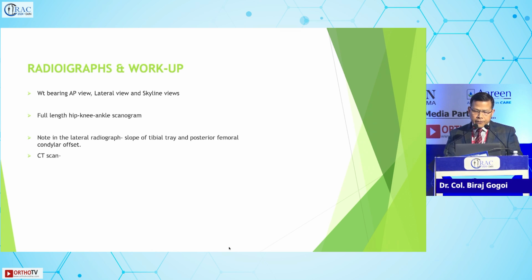And on radiograph, a complete weight-bearing radiograph series, including AP, lateral, and skyline views should be done to scrutinize the fixation, alignment, and sizing of the component. Full-length hip, knee, ankle scanogram should be done.